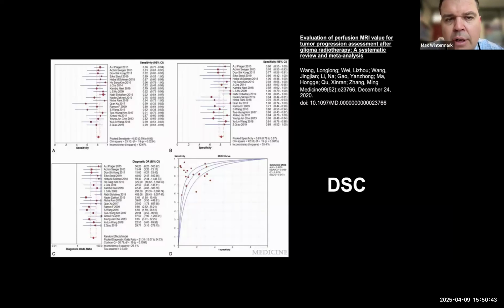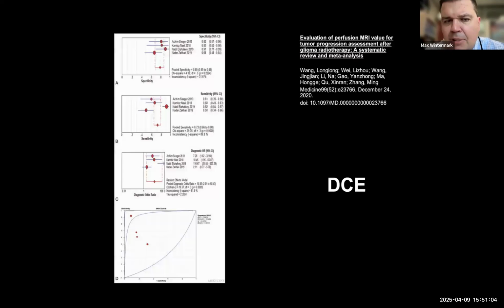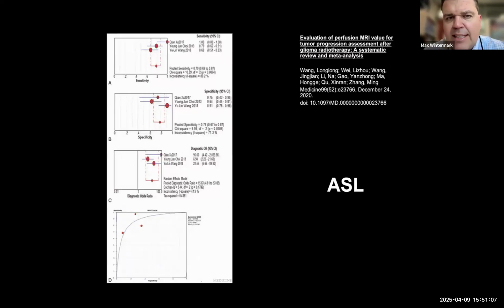You of course have to take that information together with the rest of the imaging exam and with the rest of your clinical evaluation. That's also why, at times, we'll perform more than one technique so that hopefully they converge towards the same solution and increase our confidence in the diagnosis. What I just said is true for DSC, but it's also true for DCE and for ASL. None of those techniques is perfect. But they all provide some additional information, come with a few pitfalls, and when they converge towards the same response, they are usually pretty reliable.